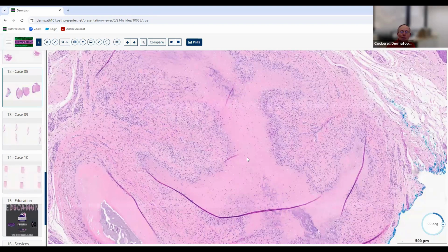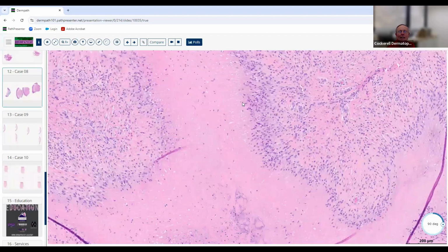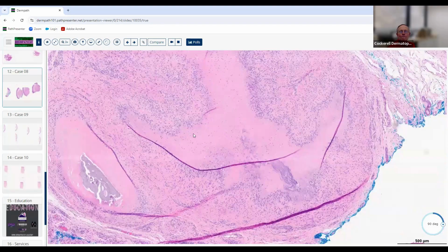Now, you can also see this sometimes in subcutaneous GA. You'll often get more mucin there, but sometimes you can see some fibrin as well. But this is a beautiful example of palisaded granulomatous dermatitis. So just make sure you know the differential diagnosis: fibrin, rheumatoid nodule; mucin, GA; degenerated collagen, and more of a layer cake diffuse pattern with necrobiosis lipoidica.